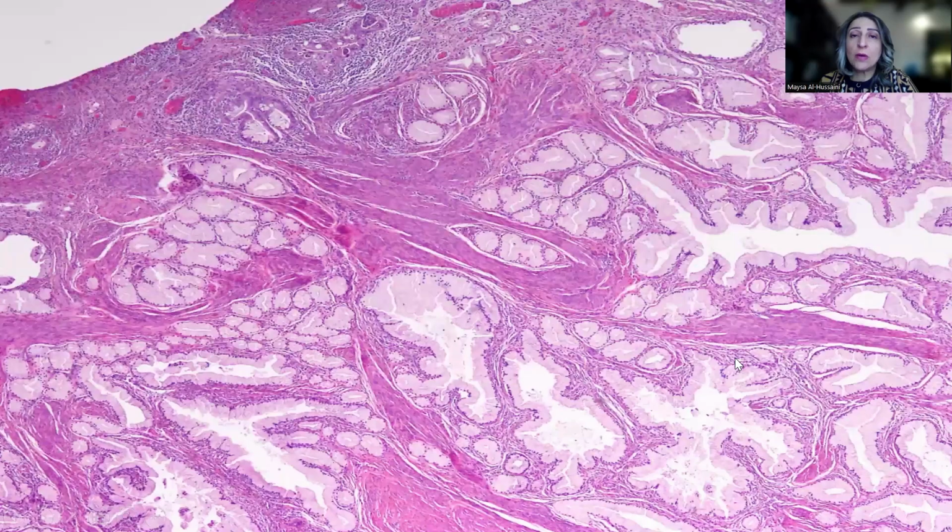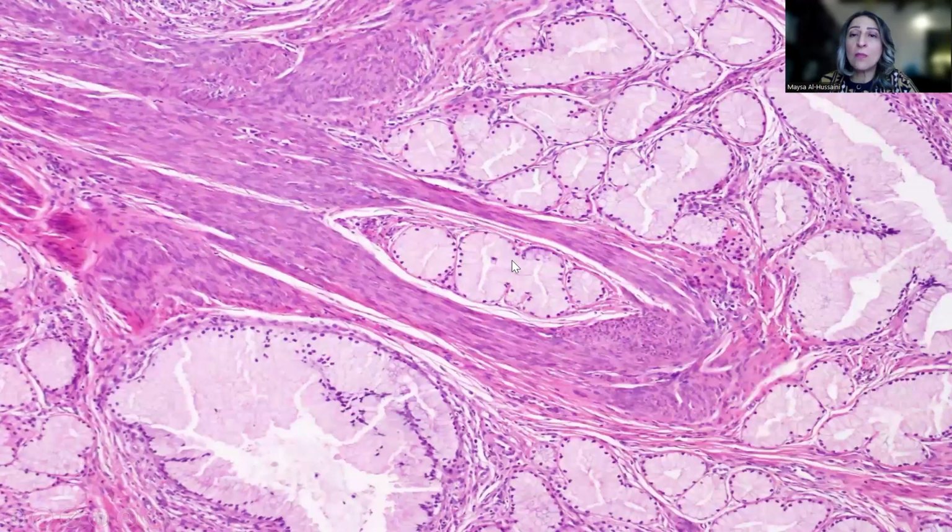the cervical stroma. On intermediate power magnification, as you can see, we have here well-formed glands with some sawtooth appearance that are lined by cells with abundant clear cytoplasm. On a slightly higher power magnification, you can see again the glands with very small, minimally atypical nuclei, but what is really very characteristic is the voluminous cytoplasm.